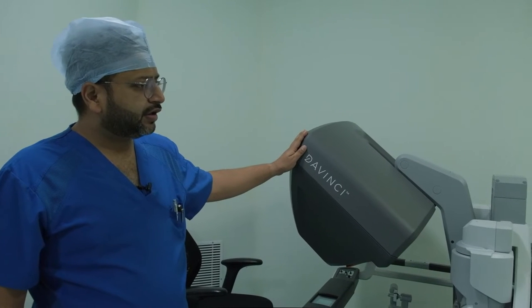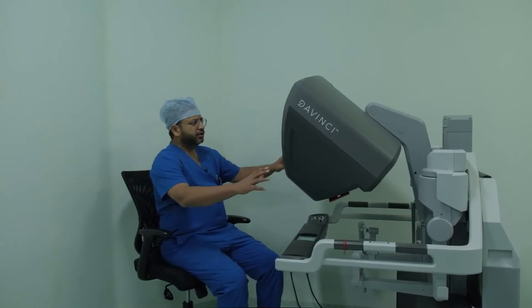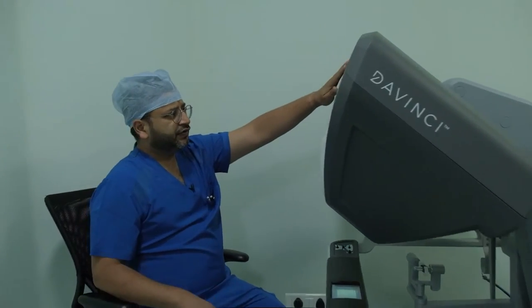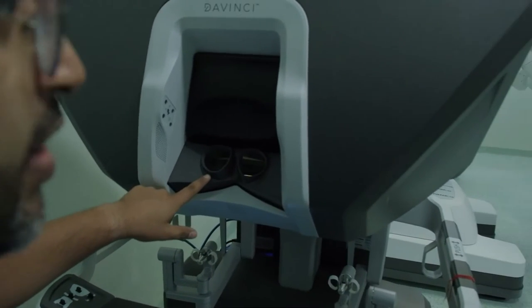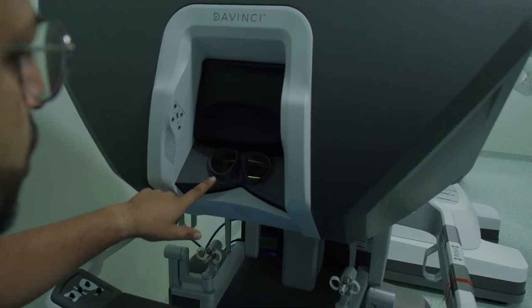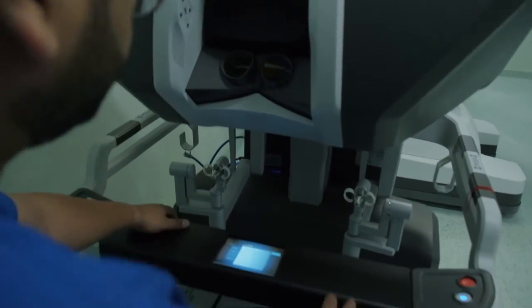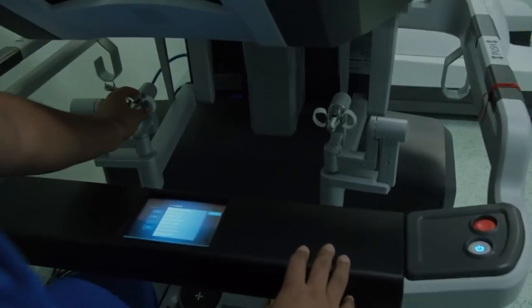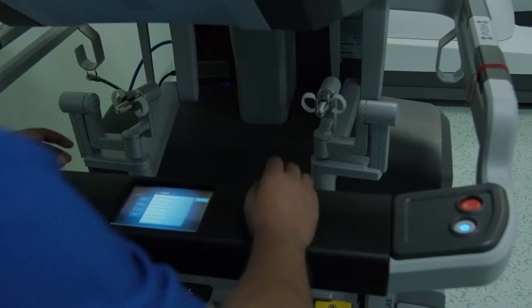This is the da Vinci Xi surgical console, where the surgeon will sit and will control all the instruments. If we talk about this console, this is a shell. This shell has the stereo viewer, which gives us a three-dimensional high definition view of the surgical field. It has the hand controls. These hand controls are used to control the instruments using the surgeon's two hands.